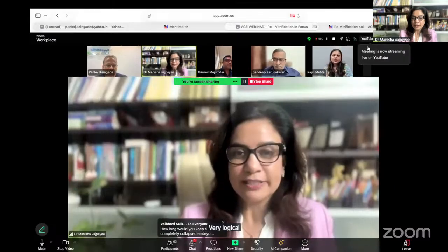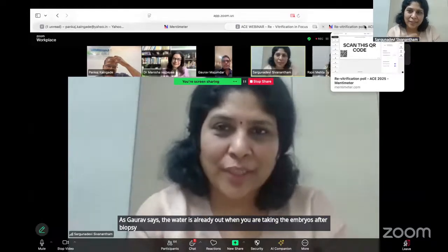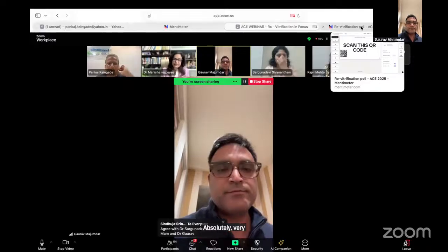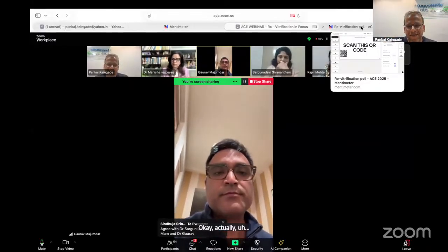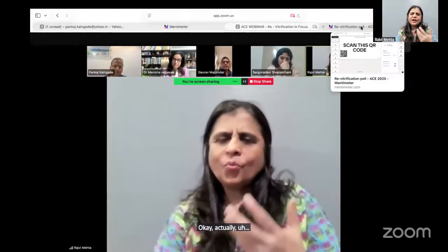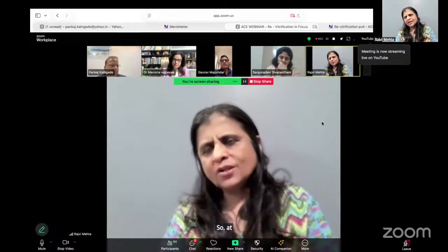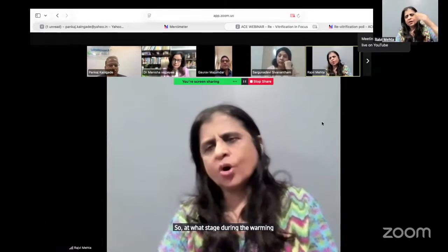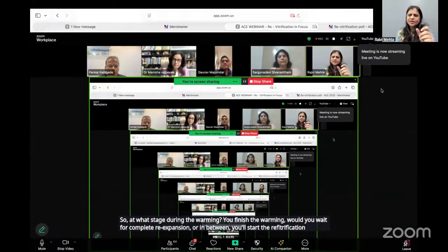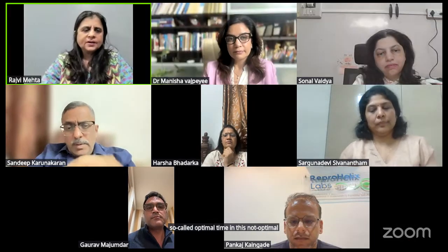As Gaurav says, the water is already out when you are taking the embryos after biopsy. So why do we need to refill the water and then dissolve it at the time? Absolutely very logical. Okay. Also, when you're doing it for medical reasons, like the case Dr. Sandeep said, would you wait for re-expansion? You got the news that you're not going to transfer. So at what stage during the warming, when you finish the warming, would you wait for complete re-expansion or in between you'll start the revitrification? Is there something like a so-called optimal time in this not optimal situation?